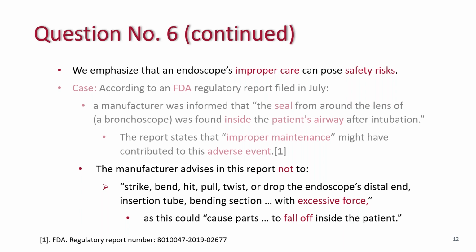Larry, going back to that point regarding the change in endoscopy, we also have a physician that's doing the endoscopy, and I know that now with the new types of procedures being done, particularly in the therapeutic area of endoscopic mucosal resections, the sphincterotomies, and even laser ablations, we have physician skills, and we also have nurses watching and being observant to how the scope is being handled. And to make sure we do a thorough inspection after those therapeutic procedures, I would advise it to be an important step to add to your cleaning process as well.